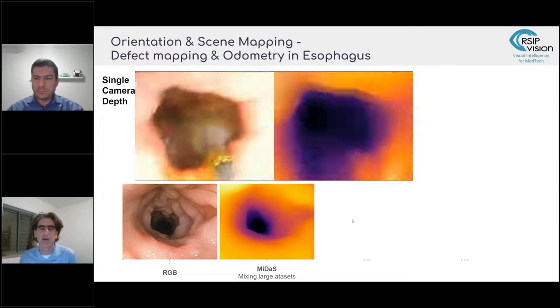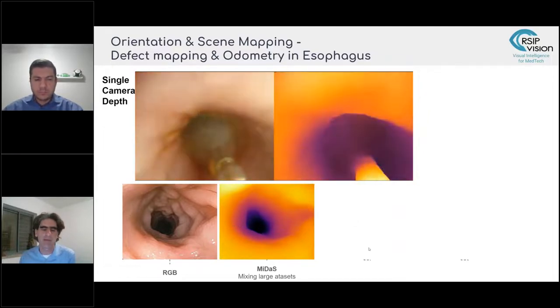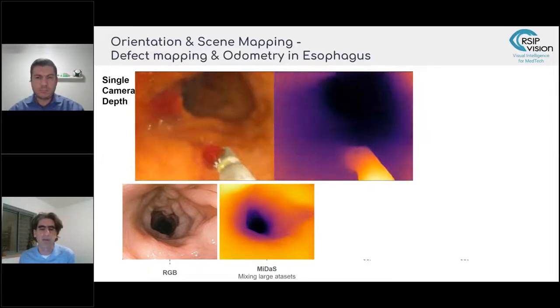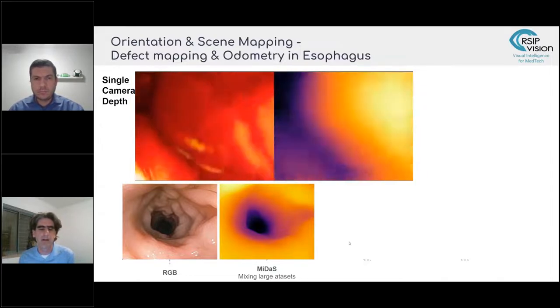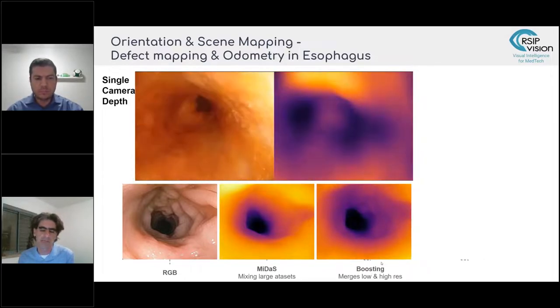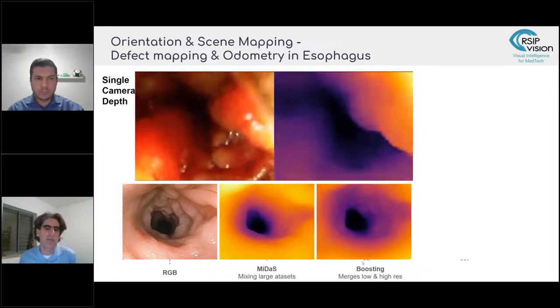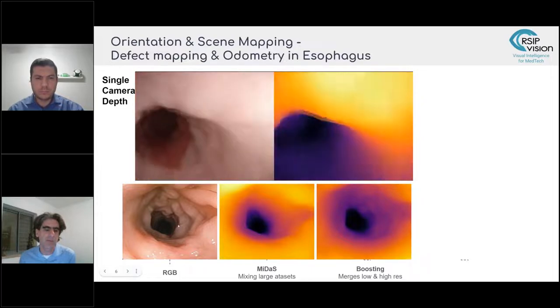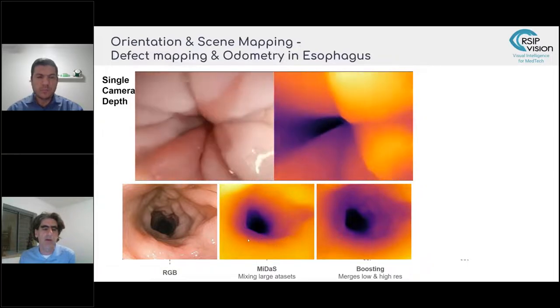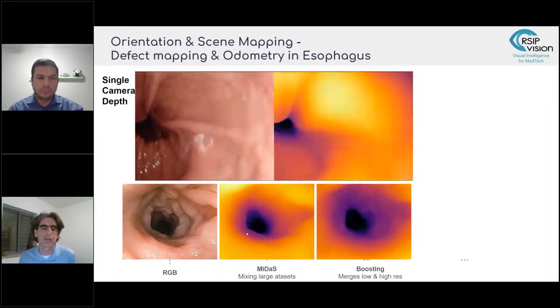It can be applied to generalize out of distribution and to assess depth in, say, medical videos, even if the system was trained on different types of medical videos, different types of tissues, or perhaps even completely out-of-distribution data. This was the first step here. The second step, which this technology took, was a boosting-based solution, which merges low and high resolutions. So many times, especially in these smooth scenes, you can get a local depth estimation, but then when you get away from the local areas, either you get something that's very blurred, or you stop seeing the large-scale features. You start only seeing the local features, just because of the way convolutional neural networks are structured.